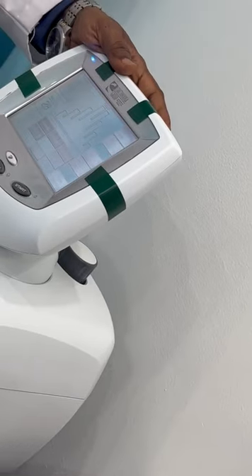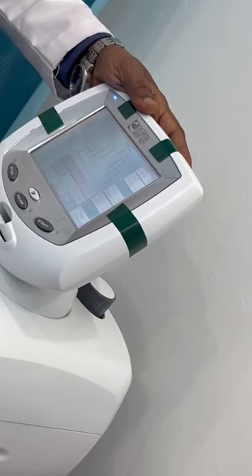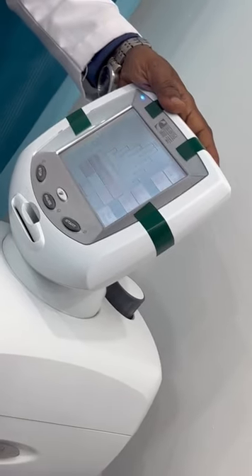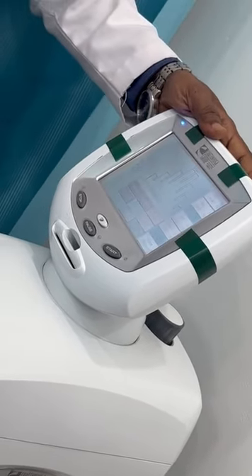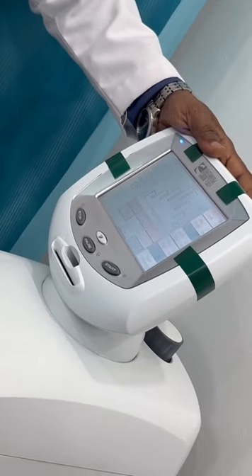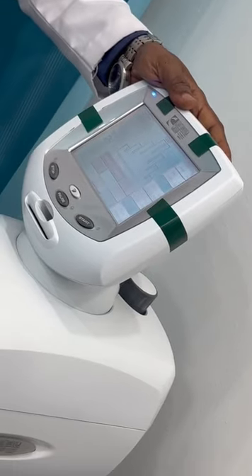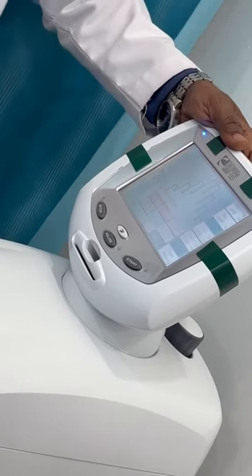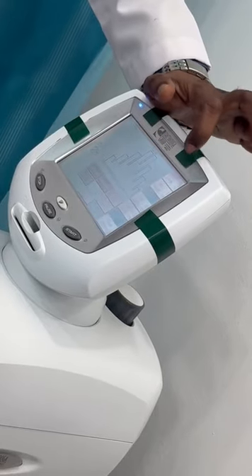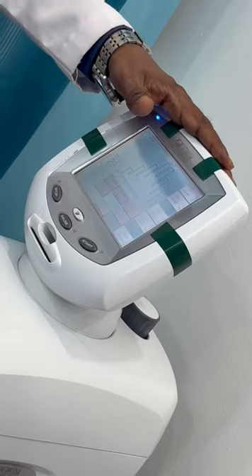From 3 kg, step 1 will be 3 kg only. Then 3, 4, 5, or 3.5, like that: 3, 4, 5, 3, 4, then 4, 5, 4, 3. It will not come to 2 or 1 or 0, so that it maintains the force. It will not come to 0 and it will maintain that same level. According to this, we can set the maximum, which should not exceed those values. 7%, yeah, that's 7%.